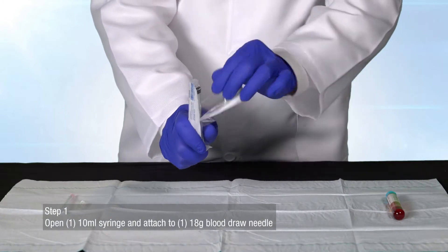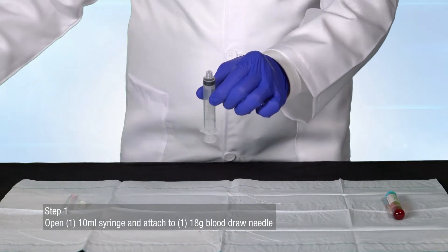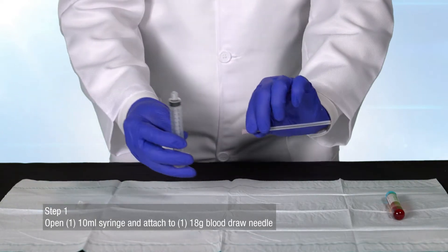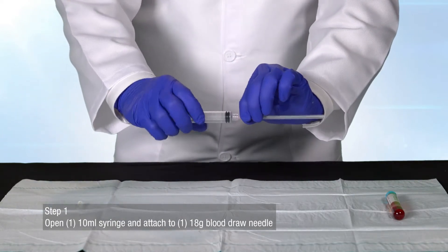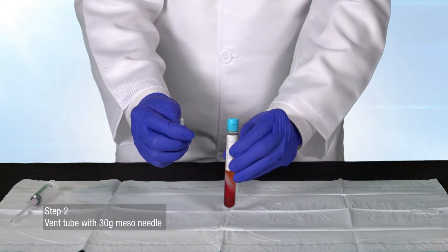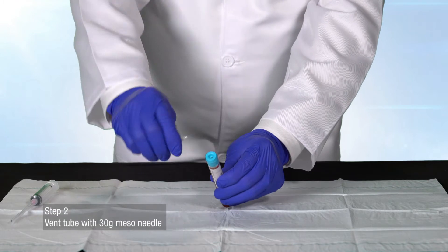Open one 10 milliliter syringe and attach to one 18 gauge blood-drawn needle. Using a 30 gauge meso needle, vent the tube of prepared platelet-rich plasma.